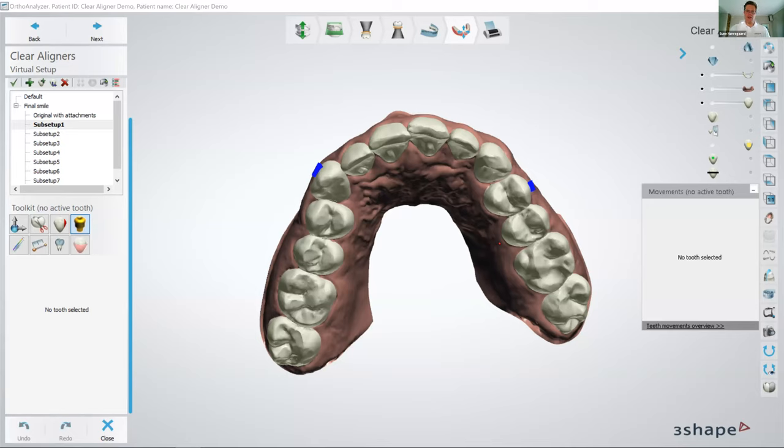So there needs to be a lot of communication going on between labs and clinics. It's the same way we see with the clear aligner providers. Either they have a platform where they have this discussion going on, or they simply call each other or email each other and so on. We have the 3Shape Communicate app. There's also 3Shape Community, but that's a different thing. But the Communicate app is the place where you have this discussion with your orthodontist about the setups. Can we design our own attachments? Yes, that is definitely possible.